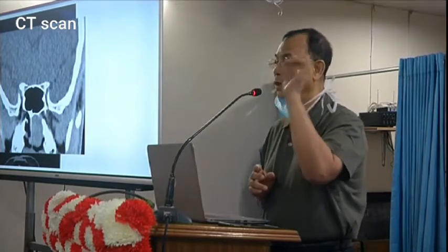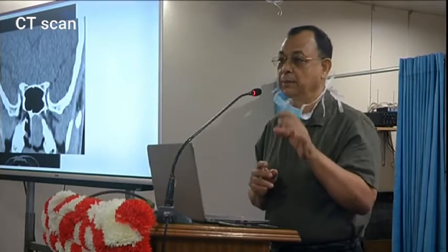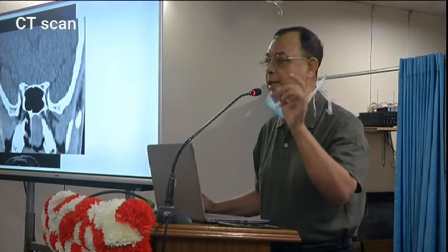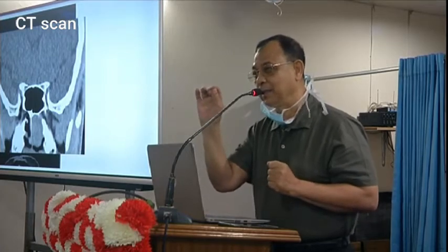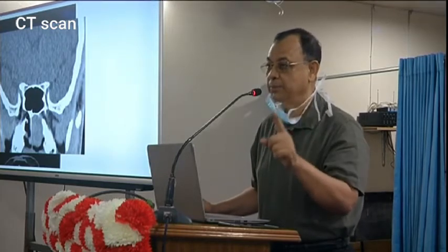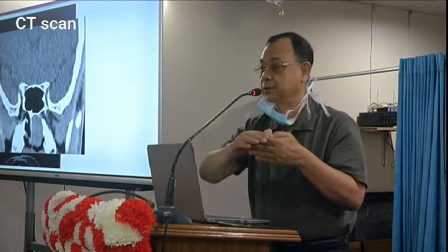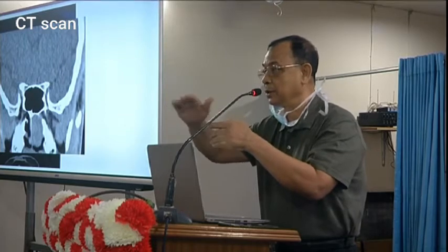If you order a CT scan, you give bony windows as well as soft tissue windows. Only the bony window does not reveal all the pathological structures. So once you advise a CT scan, write a short history and instruct that you want bone and soft tissue windows. Another thing to instruct the technician is that you want 0.6 millimeter, 1 millimeter or 3 millimeter cuts, because you need each millimeter section to see the feeding vessels and the pathology, since there is a change in pathology between 3 millimeter and 1 millimeter.